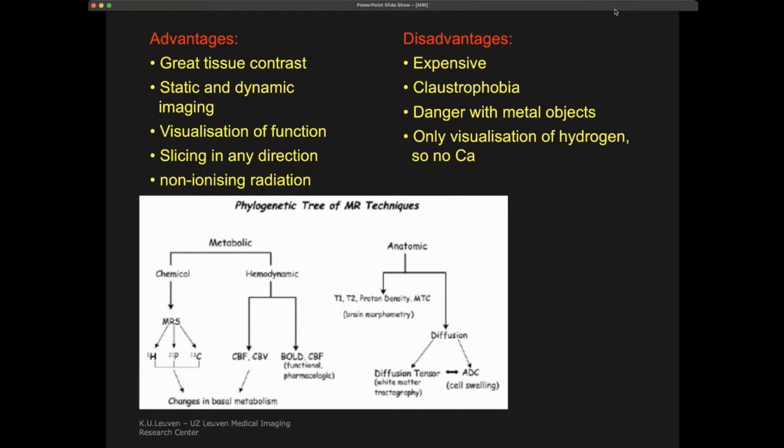Do you think, in your experience, there can be a kind of threshold to evaluate the risk versus the advantages when, for example, a patient has a specific type of implant, and you know that this implant is going to generate some kind of artifact because you have previous experience? In general, you really avoid putting patients with implants in the MRI scanner. But for example, if you have a young person that regularly needs to undergo imaging, then you don't want to use a CT scanner because then the radiation problem can be more.